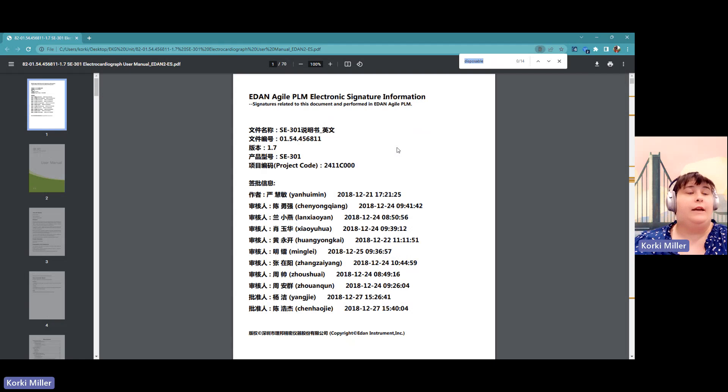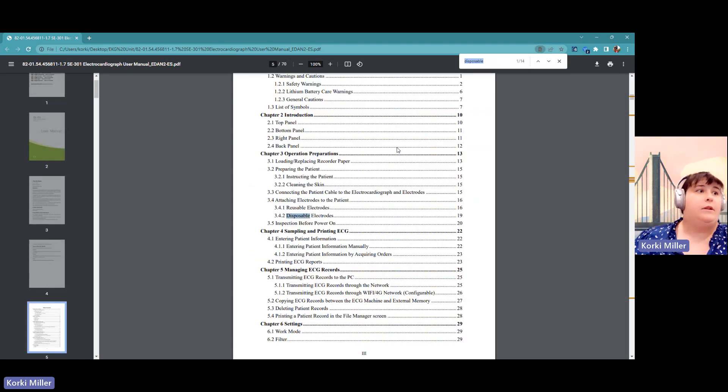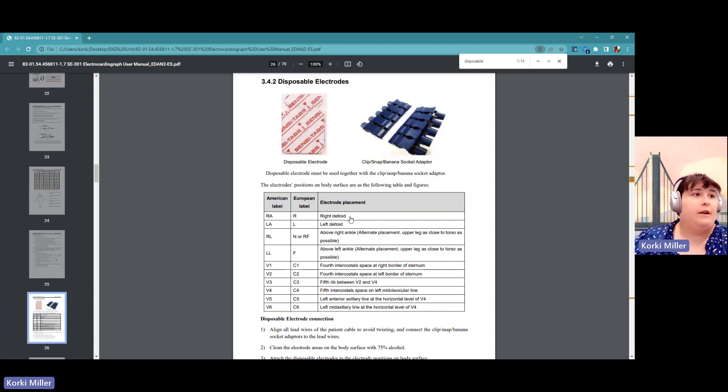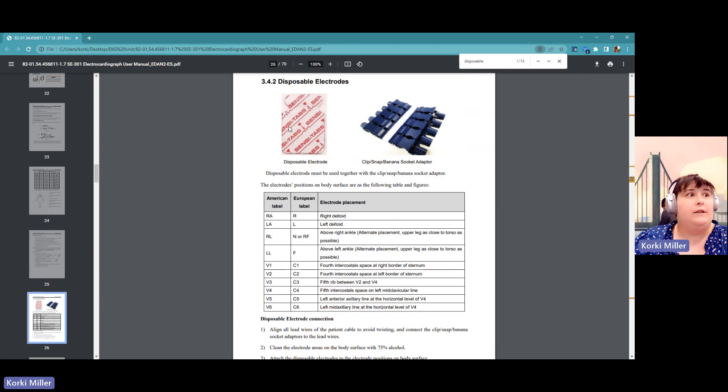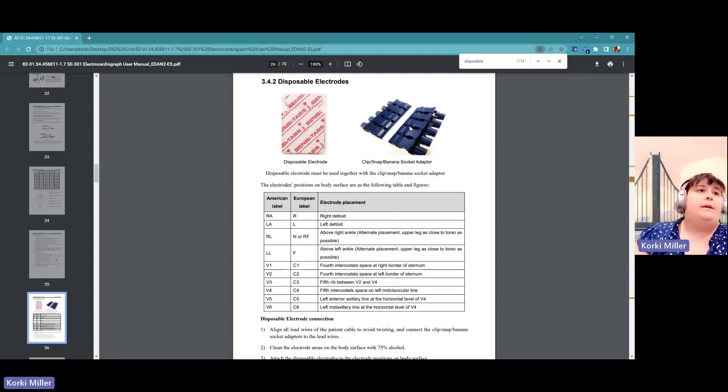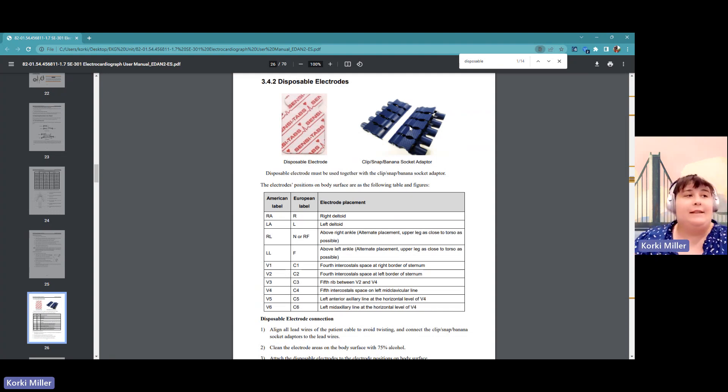Right now we're going to highlight the goal of disposable electrodes. This is what most people use in common base area. So a lot of people are using for resting EKGs, they'll do a disposable electrode and the adapters connected to the leads. Adapters come in all shapes and sizes.